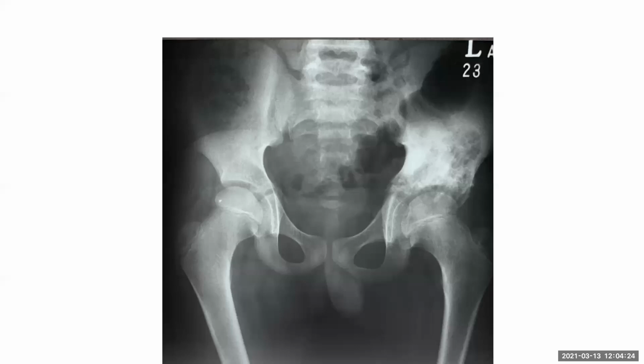I would ask if there is any previous radiograph for comparison, and ask clinically if the patient has pain in the hands and other areas to image those joints as well, with the possibility of juvenile idiopathic arthritis in a young patient.